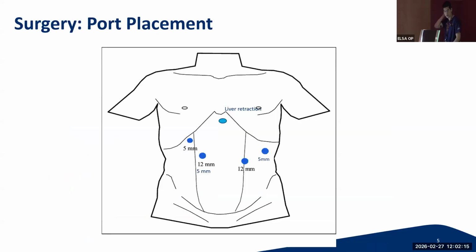So very quickly, I just move to how I do my hiatus hernia repairs. Generally, I do it laparoscopically. So I usually use a 5-port technique. I usually do optical entry through the left umbilical area, and then from there I usually use 3 5mm ports.